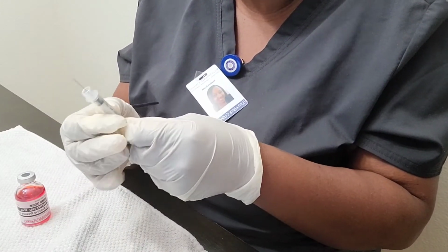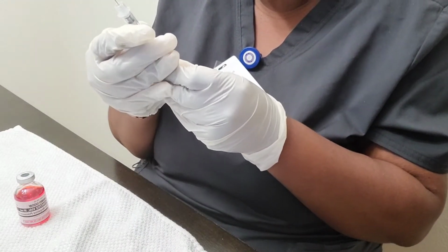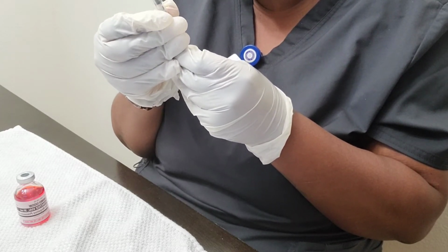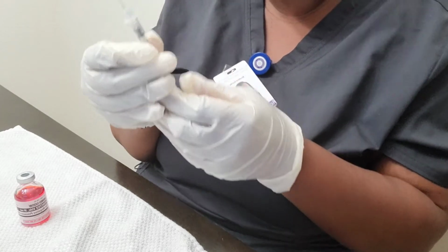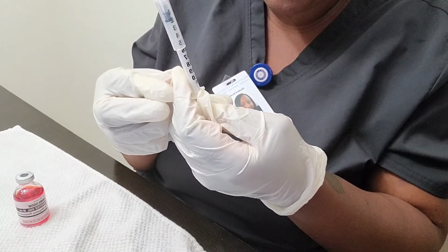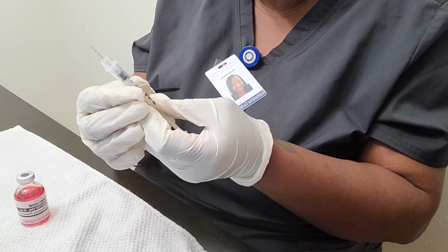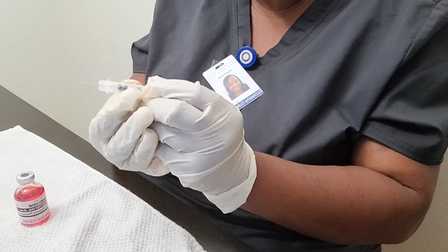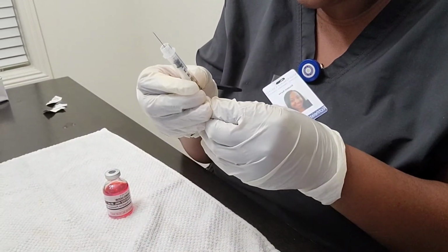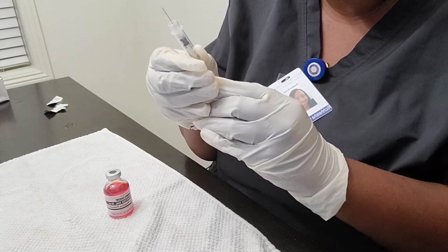So I will require that amount of air. All right, and that is 0.1 ml of air.